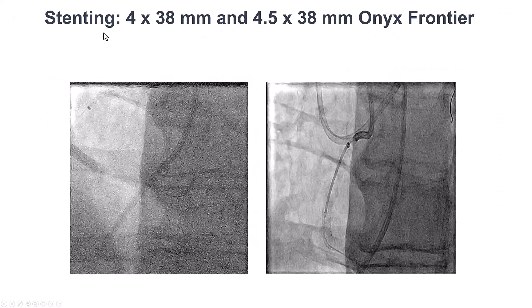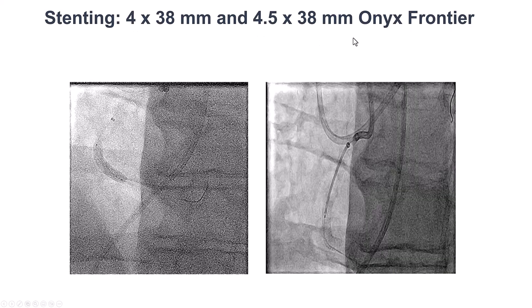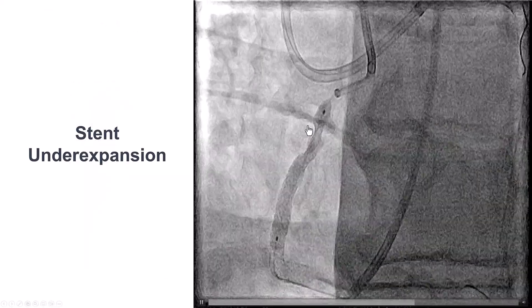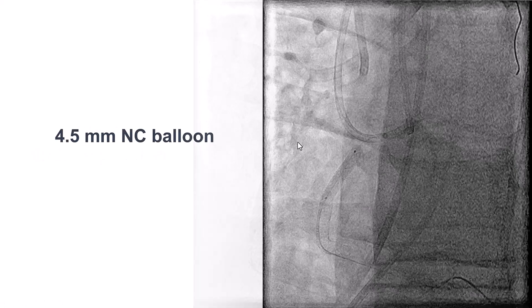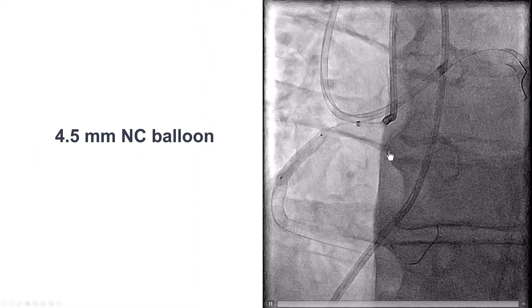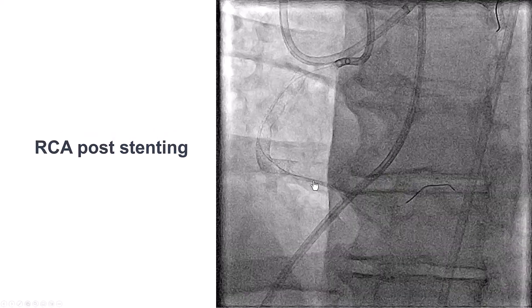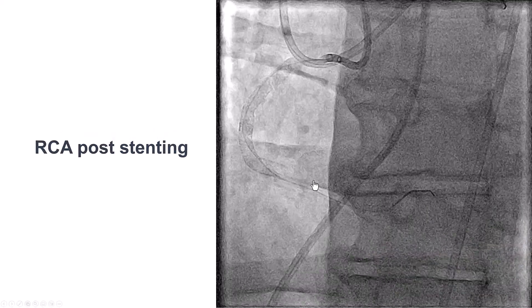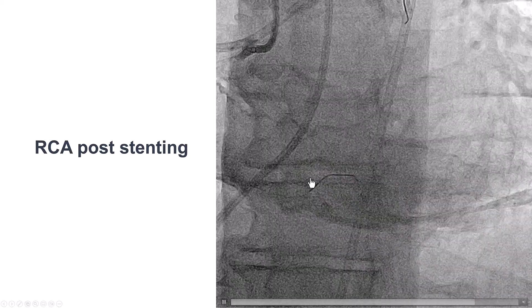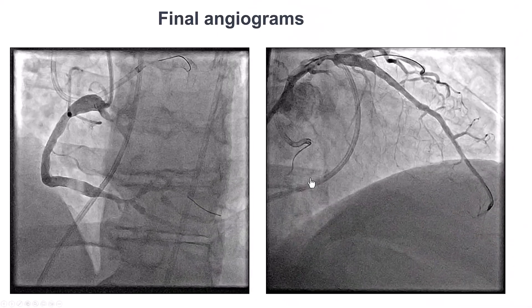We then placed two drug-eluting stents, 4×38 and 4.5×38. The stent did not expand very well initially, which raised some concern, but we post-dilated with a 4.5 mm balloon at 20 atmospheres and the stent expanded nicely. We had a nice result with TIMI 3 flow in the RCA and no stent underexpansion, both angiographically and by ultrasound.